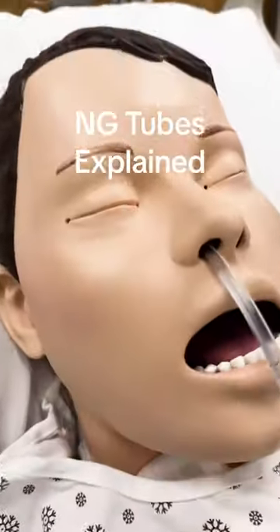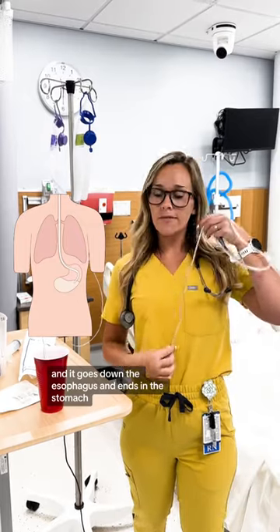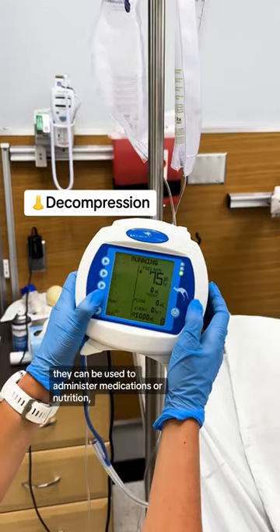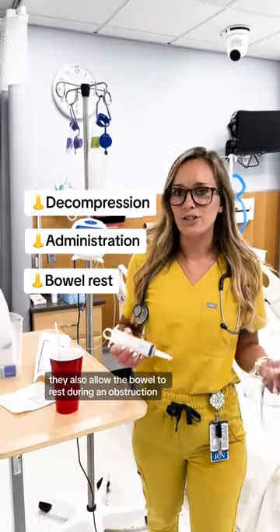Let's do a quick crash course on NG tubes. NG tubes are inserted into the nose or one nostril and go down the esophagus and end in the stomach. They can be used for decompression of the stomach, to administer medications or nutrition, and they also allow the bowel to rest during an obstruction.